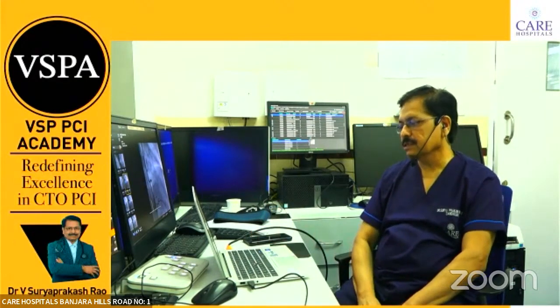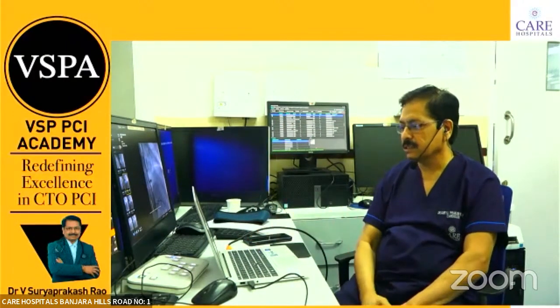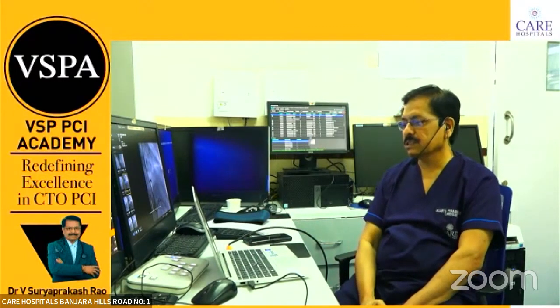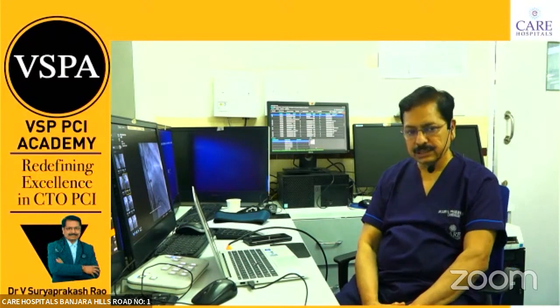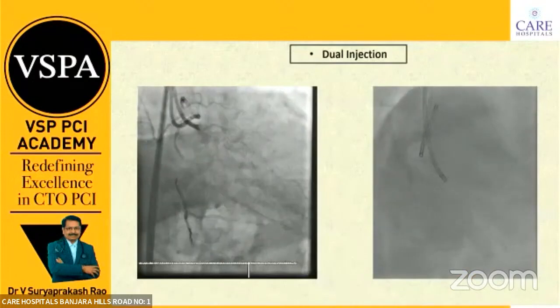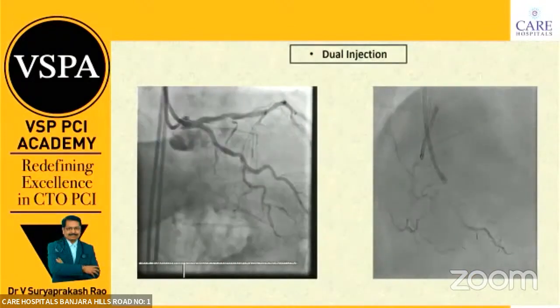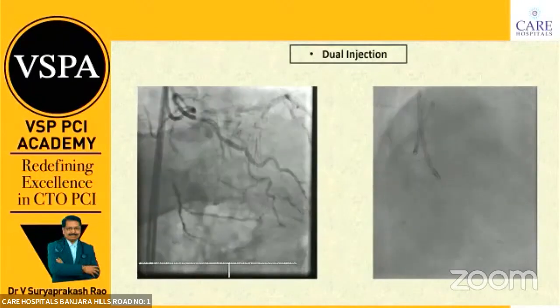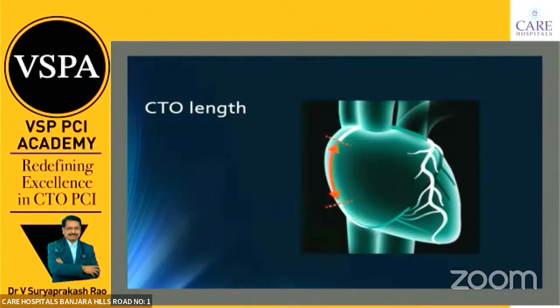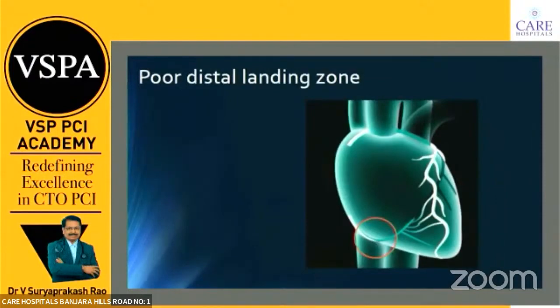So, as I said, just do the angiogram and dual injections. This is the classical dual injection. If given caudal and cranial view, what you expect in dual injection, I told you already: the length of the lesion, the calcium, and the ambiguous cap, distal vessel, the collaterals, all information you get in one, two shots, two angles of dual injection. This is a fundamental thing every operator should do. And as I said, ambiguous cap, CTO length, and the distal cap, landing zone. This is very important.